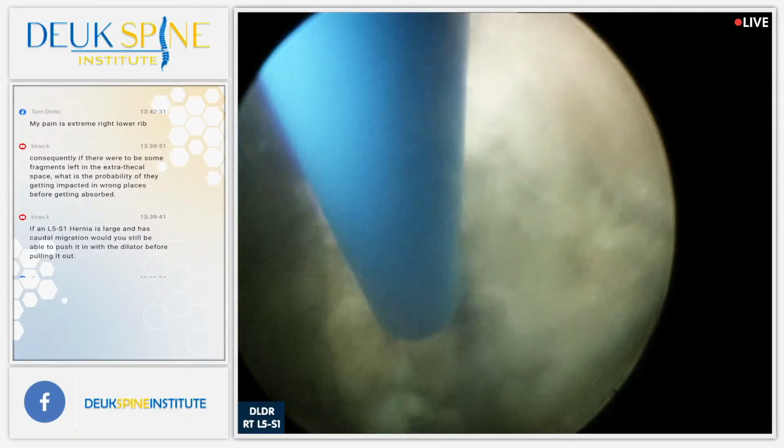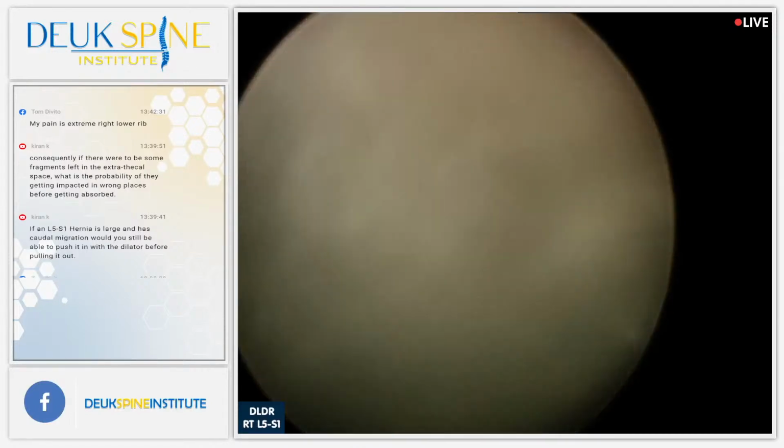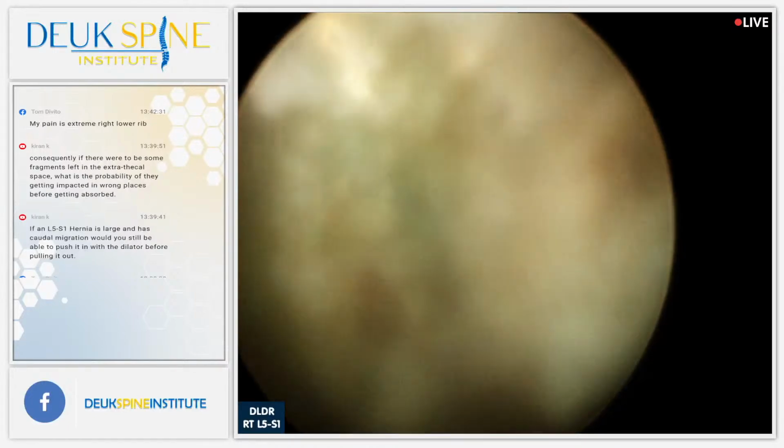We're pretty much done here. We're done, yeah. Oh yeah, this is the worst part right here. We're there. You're doing great. Hang in there, buddy. All right.